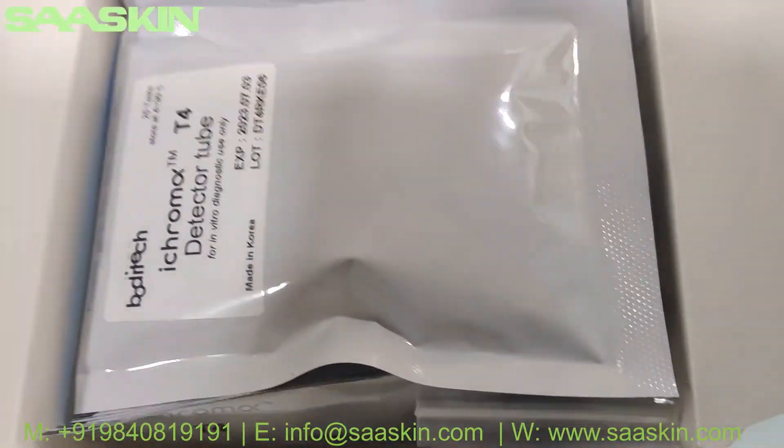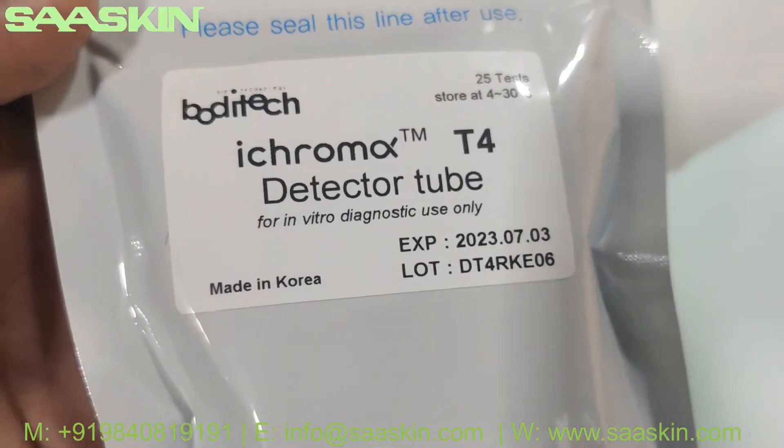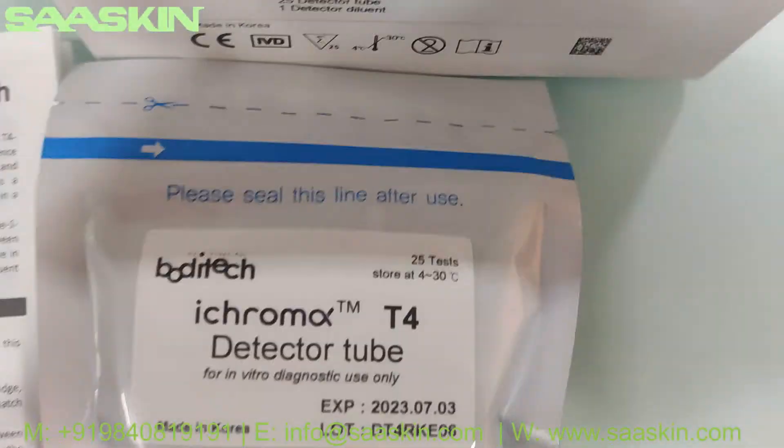Further inside, you have 25 detector tubes — this is a sealed pack of 25 detector tubes.